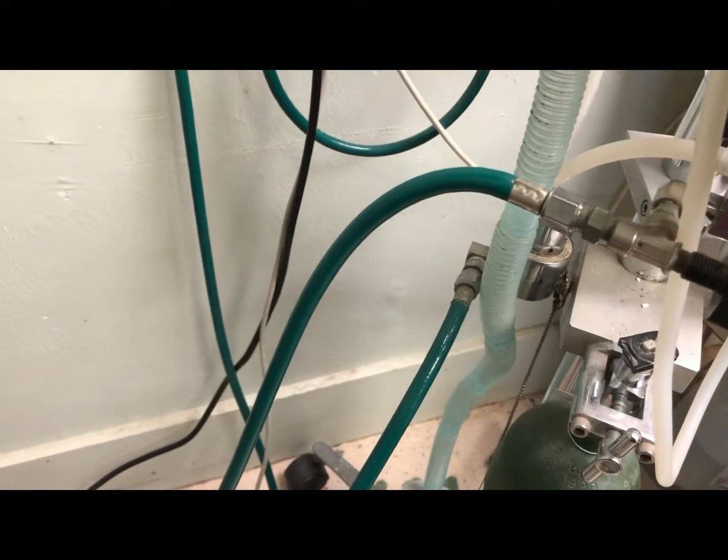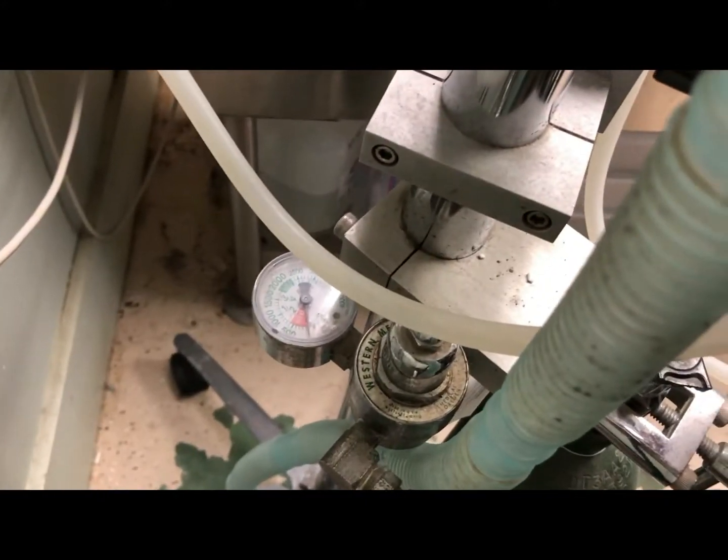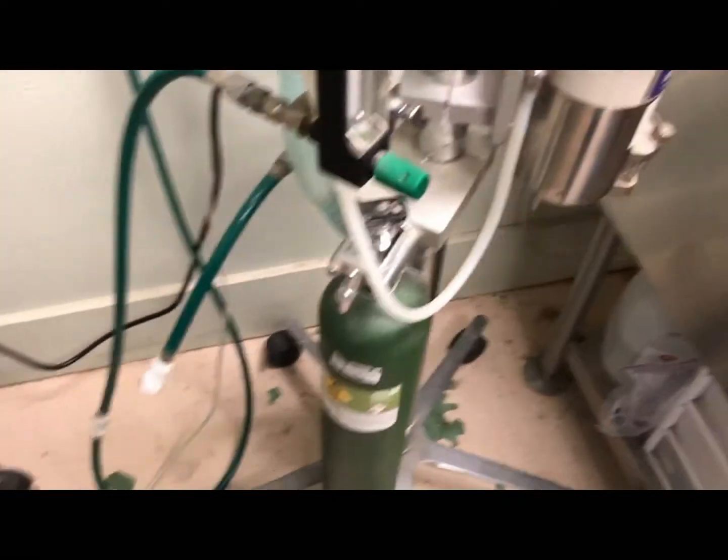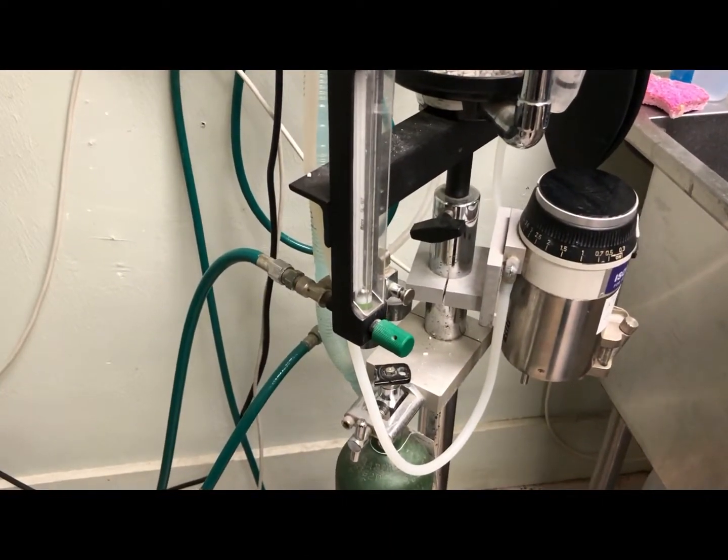It also goes through our line pressure gauge, which is hidden back around here, and then I will show you the rest of the system on our nicer machine up in surgery.